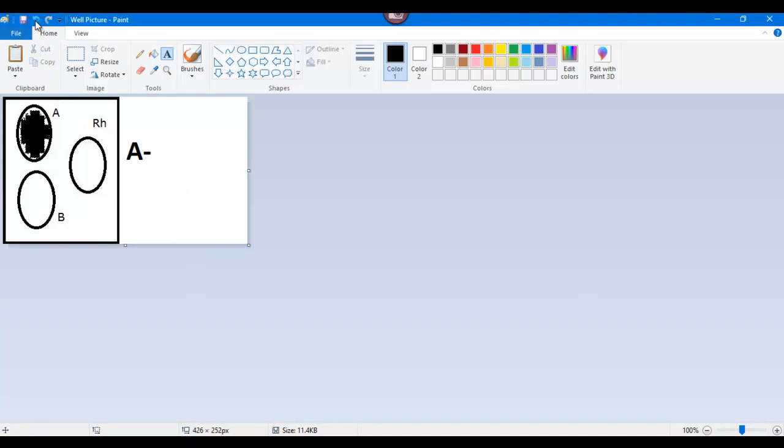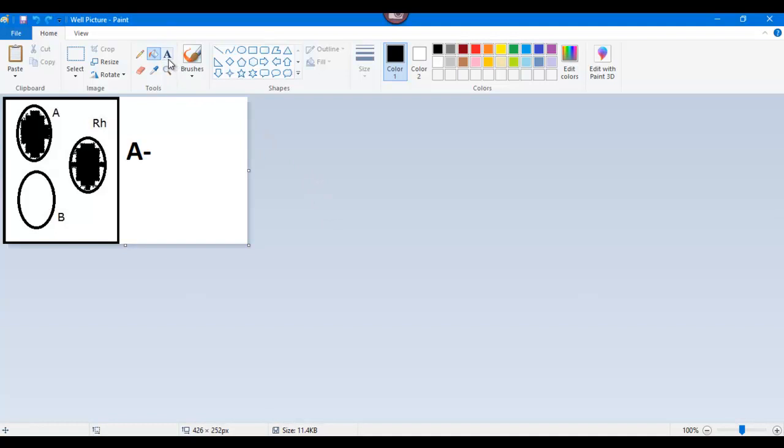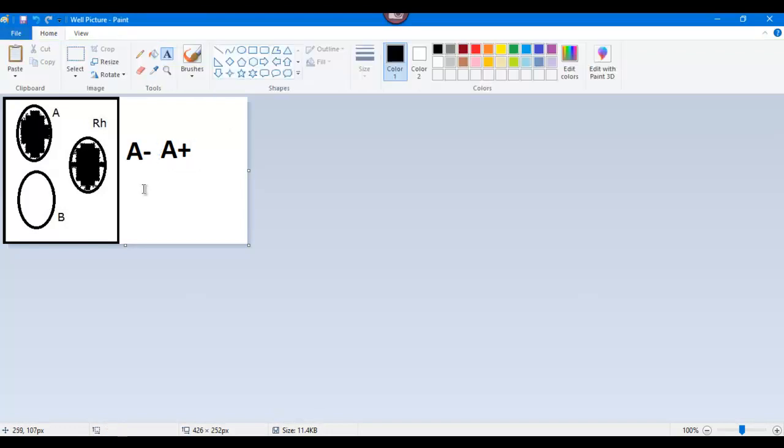All right, we good with how this is going to go? I hope. What if you come back, this one clumped and that one clumped? What is their blood type? What if the A clumped as well? No, I'm sorry. Let me do this again. All righty. So what happens there? They are A positive. So we're going to just erase that off. There we go. The A clumped and the RH clumped, which means they have the antigen D, and the B didn't clump. So that's how we're going to do this.